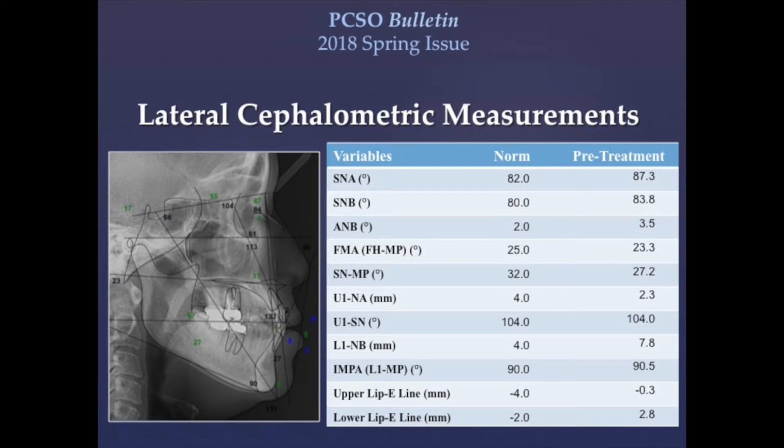Treatment objectives. The goal of treatment is to improve the smile and even the incisal display, at the same time correcting to ideal overbite and overjet and correcting the cuspids and molars to class 1, so there is ideal function, anterior guidance, and cuspid rise. The lips are apart at rest and the patient is able to swallow without lip strain. Maintenance or improvement of facial balance is desired.